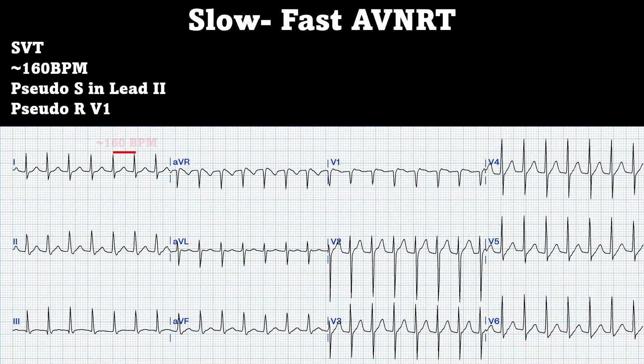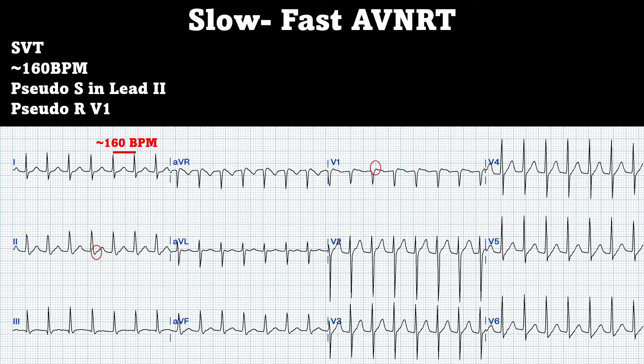Here's our example of slow-fast AVNRT, which is our most common. Some of the EKG findings you're going to get are right around 160 to 170 beats per minute. You're going to have absolutely no P-waves, including retrograde P-waves, or you can have a pseudo-R in V1, which we can see there — it's a little blip that's a retrograde P-wave. You can also have a pseudo-S-wave in your inferior leads, which you can see in lead 2. But this is going to be your typical type of SVT pattern.